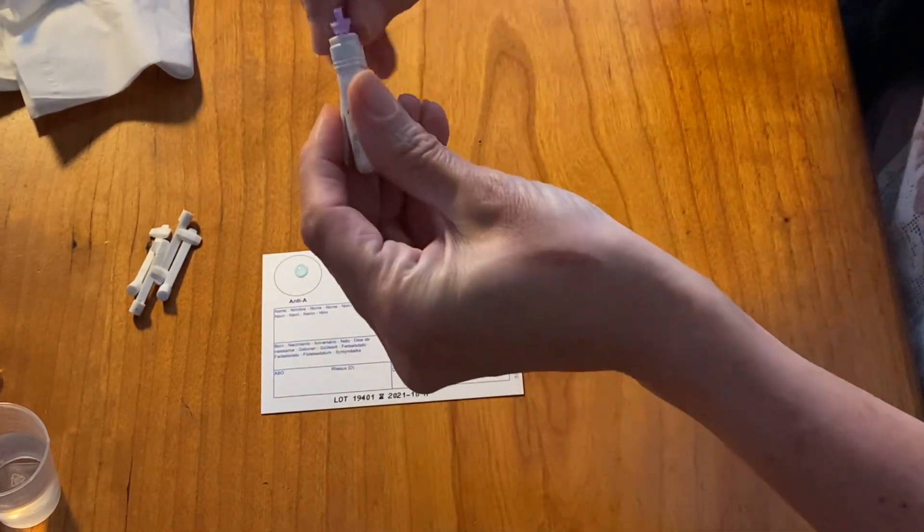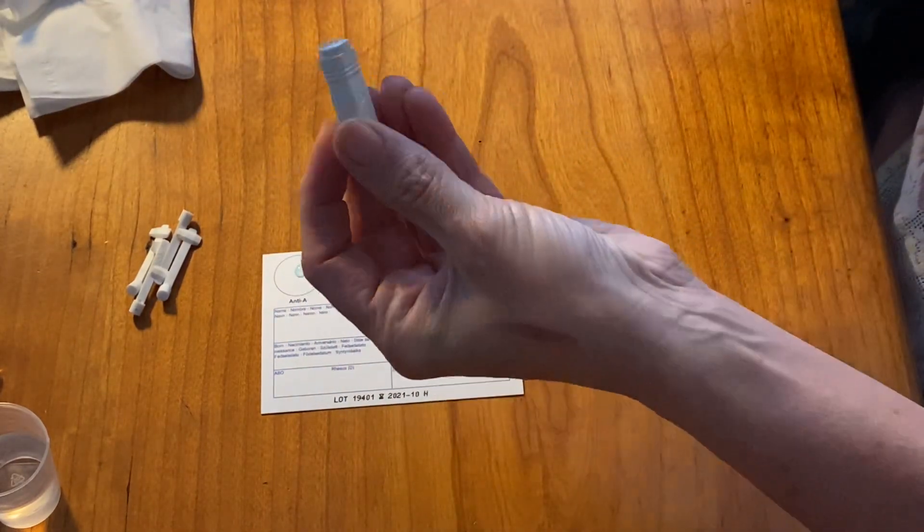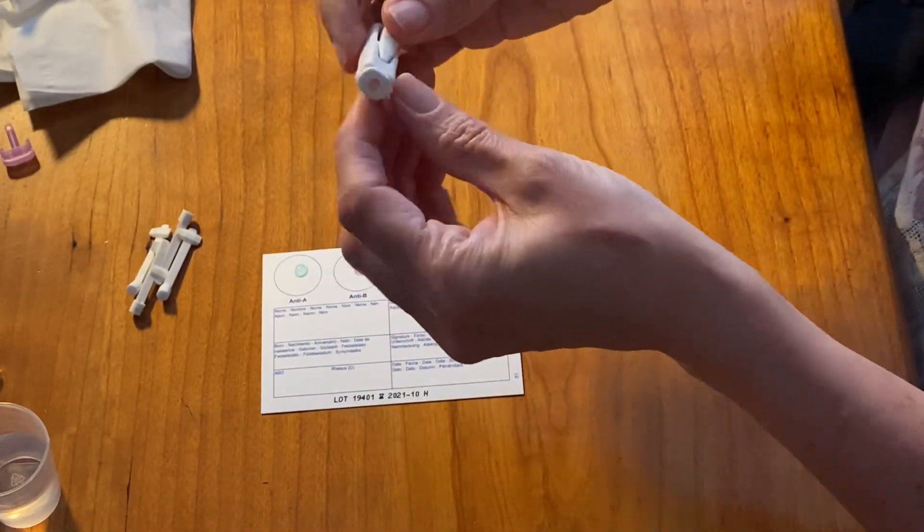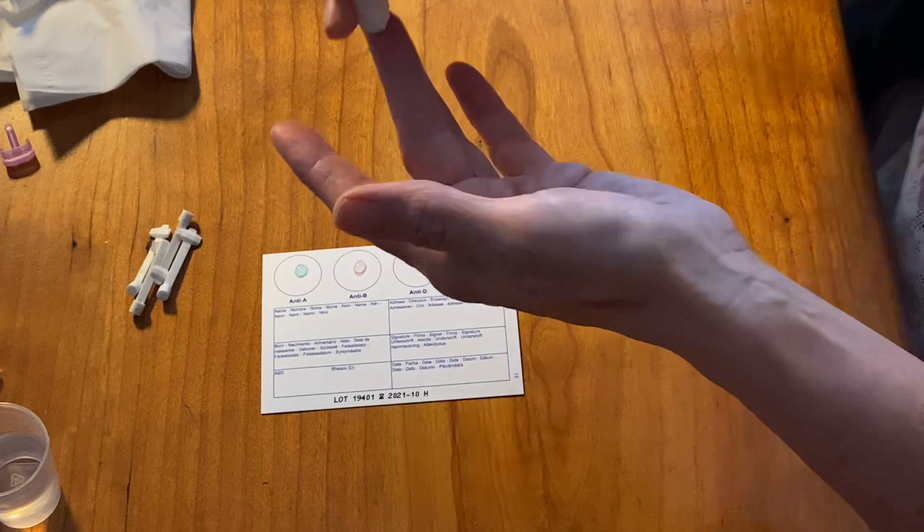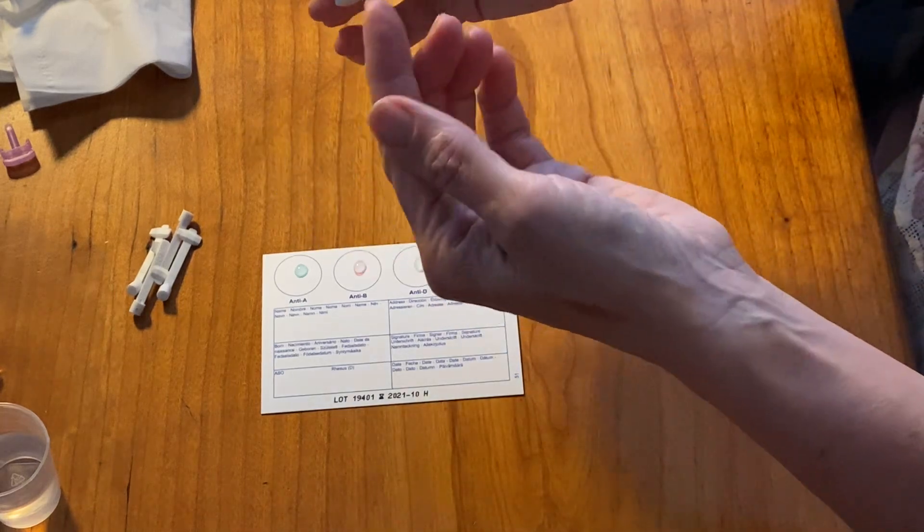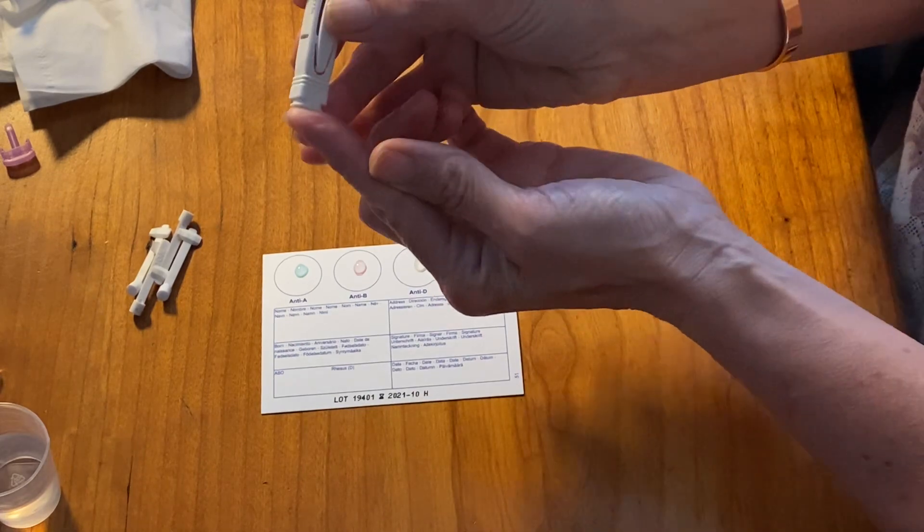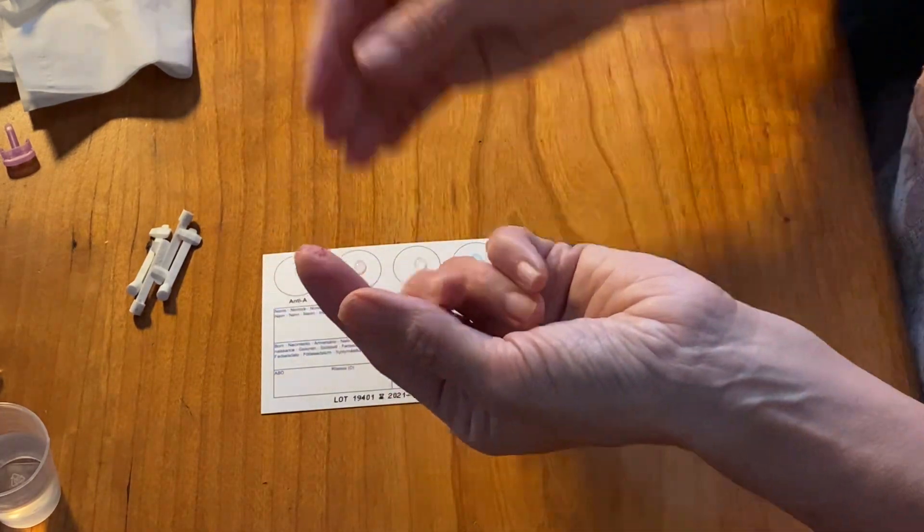Now we use these lancets, you just pull off the top. Sometimes it's just a little stick, sometimes it's a puncture when you just push it down, but this one has a little lever. I'm going to puncture in here because it'll make it easier for doing the blood.